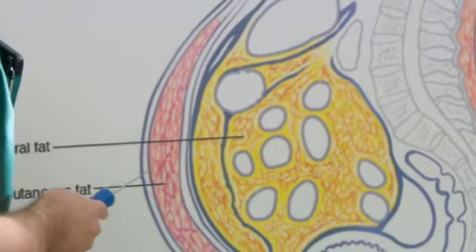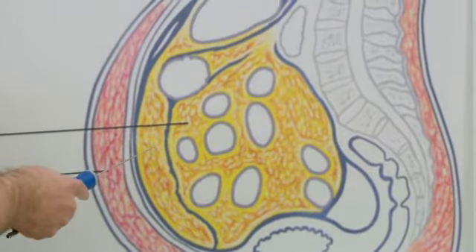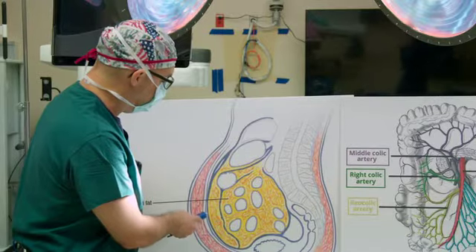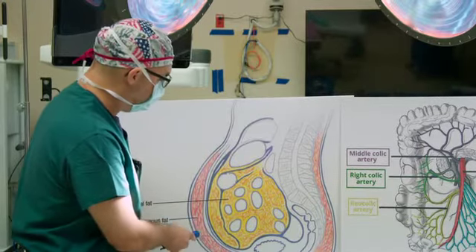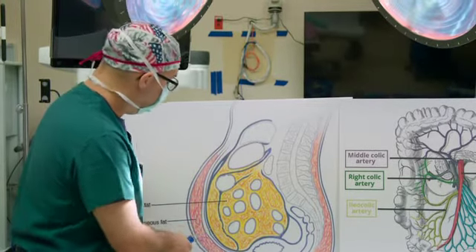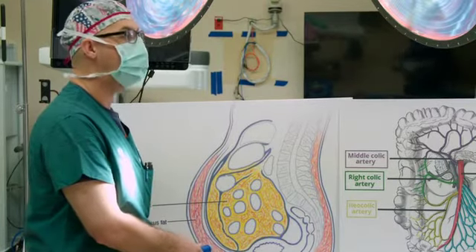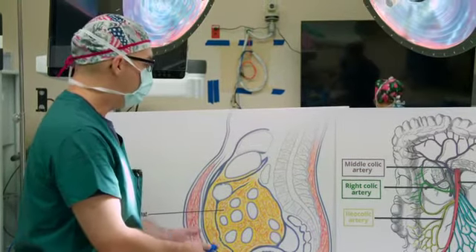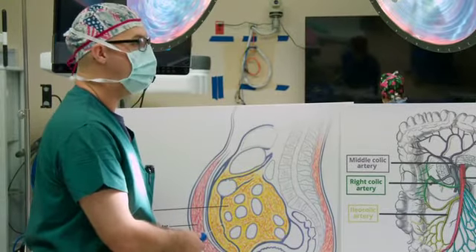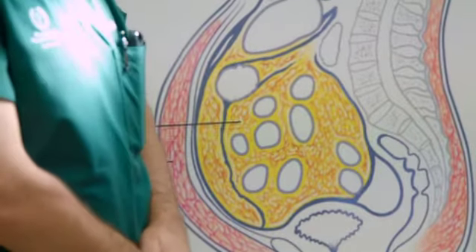This is that subcutaneous fat that you were asking about. So there are different types, and I'm glad we've highlighted them in different colors, because the yellow is the area we're working in. This fat here, the mesenteric fat, we're actually going to be going after using the HydraSolve device today. And that's where we're seeing this fat seems to be more metabolically active, meaning that when food or things are coming in, that triggers that fat and triggers a response. This has never been done before in human beings.